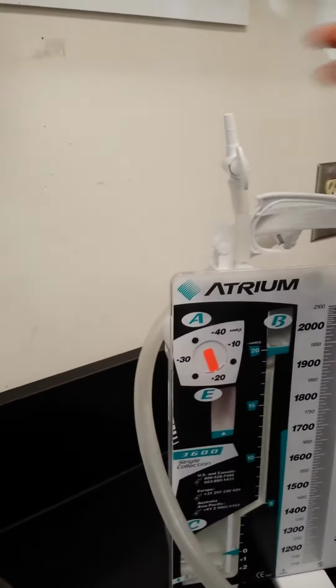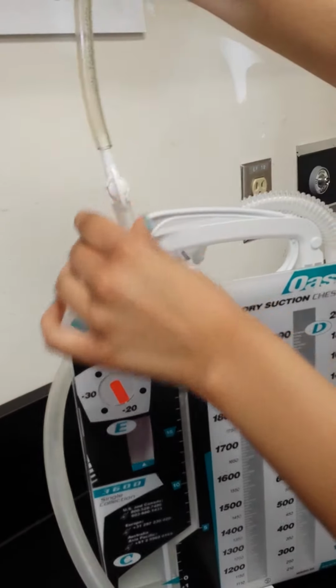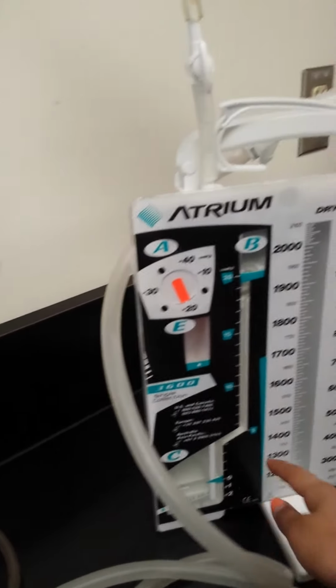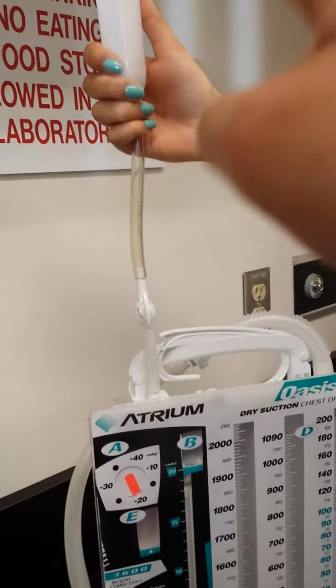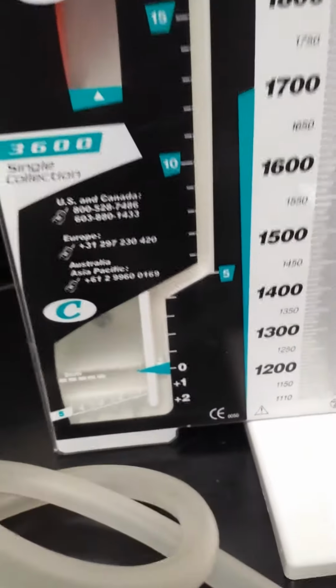We put a funnel on it. We put this funnel, and then we close this. We'll close it, put the water in, and then open it so you can slowly see it fill up. So then, it goes into 2. You need to put the water in there, and it goes all the way down to fill up in here, and just fill up to 2. It should fill up to 2 right there, and that's the only thing you fill in this chamber.